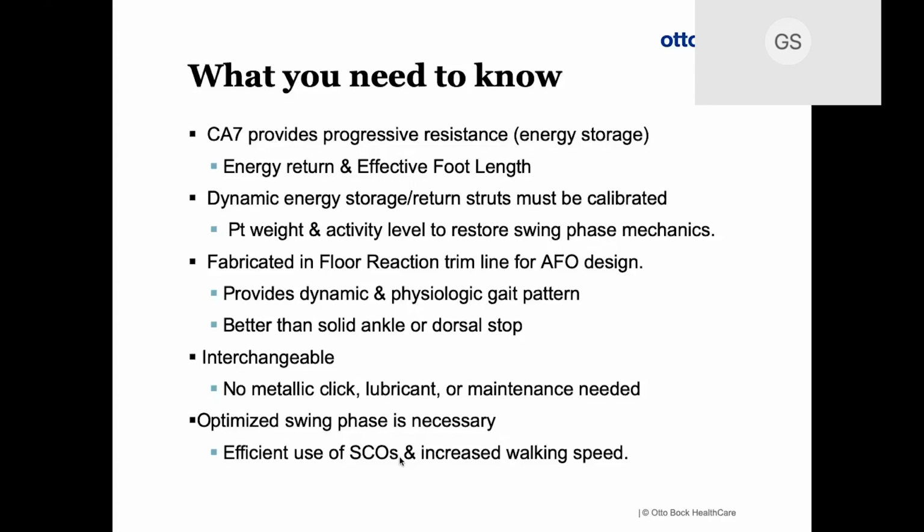The one nice thing is that it is interchangeable. You don't have a mechanical click or metallic click with a mechanism. No lubricant or maintenance is needed, but you should always watch out for any sort of scratch or nick, because that's where crazing occurs, where the resin begins to pull apart. But it's been tested and optimized for your particular walking speed and need.